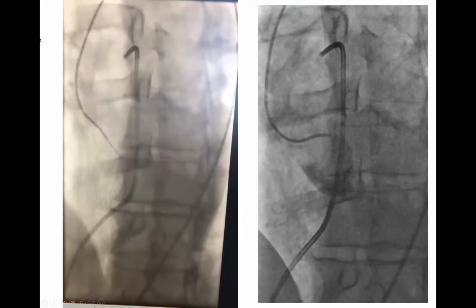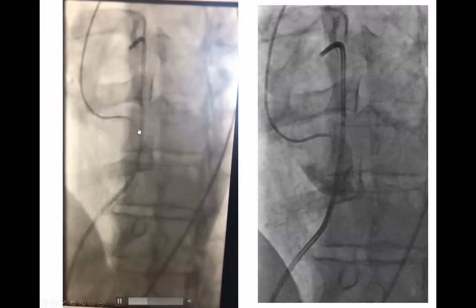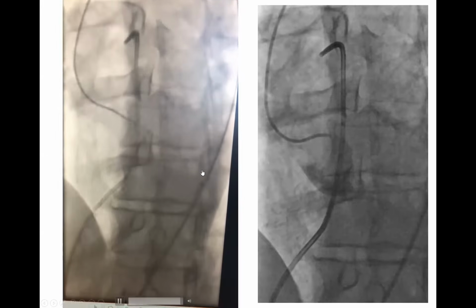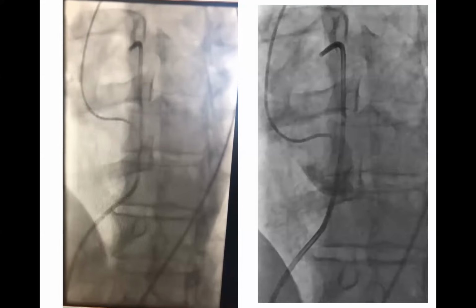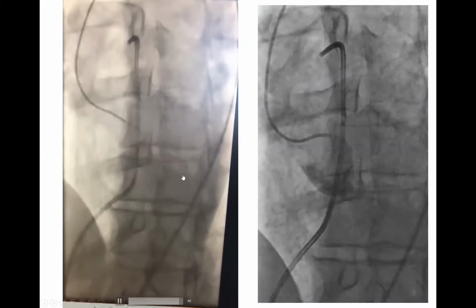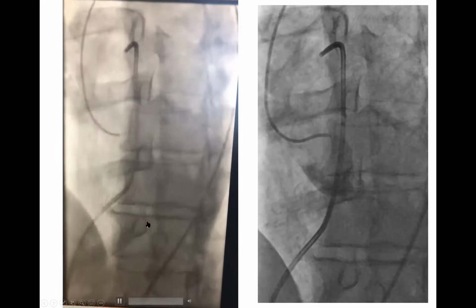Okay, so I put that catheter in, but that catheter is not great. It's very irritating. It pokes the ventricle and creates ectopy. So you have to exchange. So you advance this, then you advance the catheter. Then you put an exchange length J wire that is friendly to the ventricle. Then you exchange for another catheter, such as an exchange length pigtail catheter, such as a double lumen pigtail catheter, to measure the LV aorta simultaneous gradient, okay?